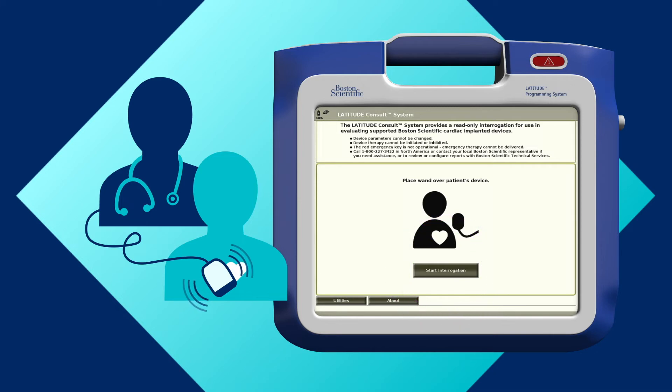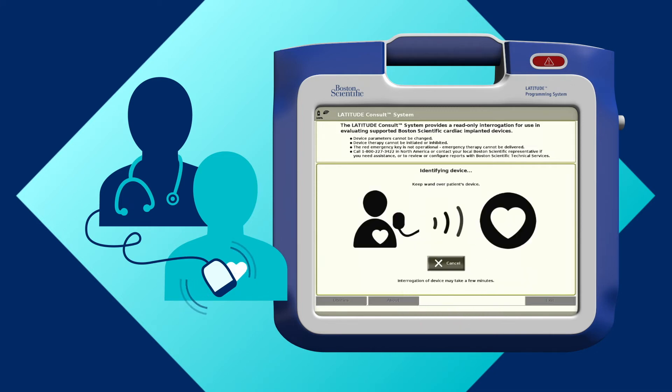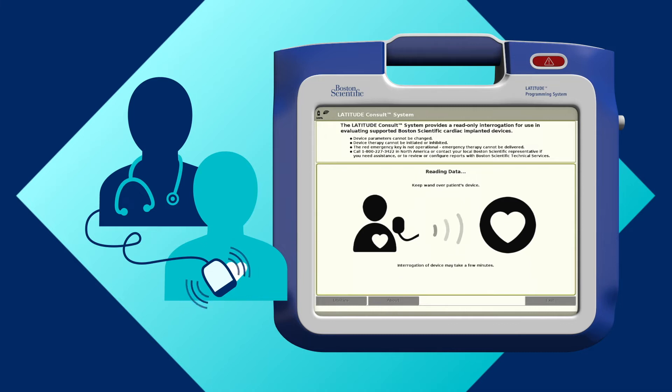Press the start interrogation button and follow the on-screen instructions to read and send data to the secure Latitude Consult server. A green light will blink on the wand indicating telemetry to the implanted device.